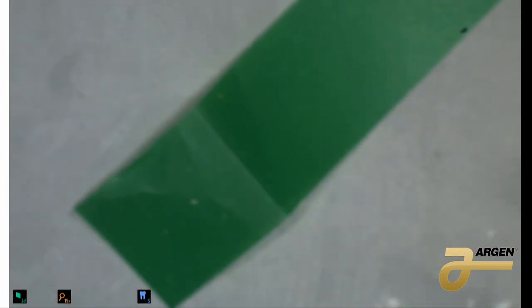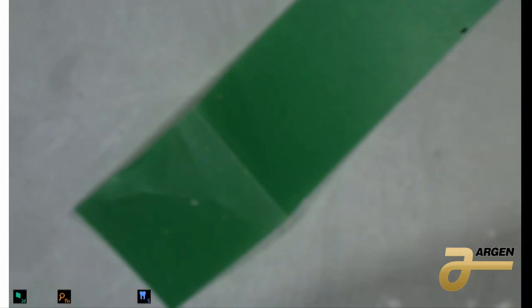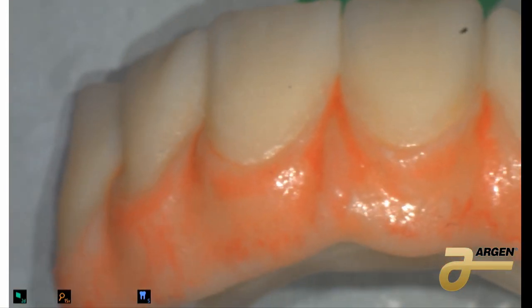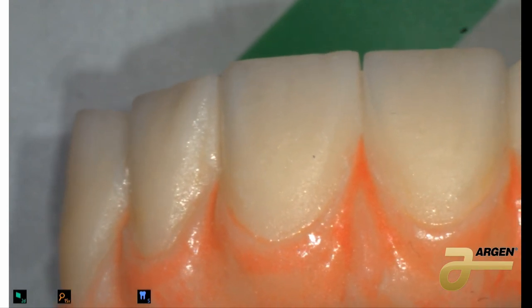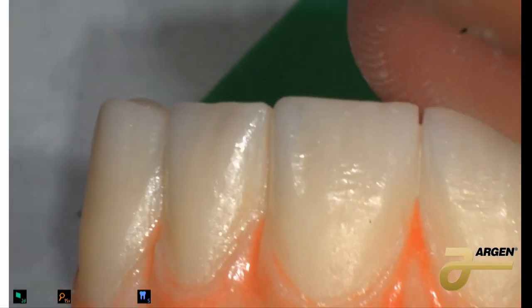After we cook this, I'm going to put it in the oven — imaginary oven — and we're going to get something coming from the oven. So you see all the zirconia around, all the colors, and everything coming together nicely. The next thing we're going to work with is the first bake.